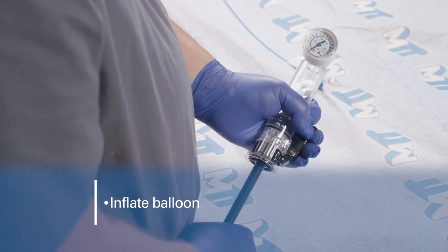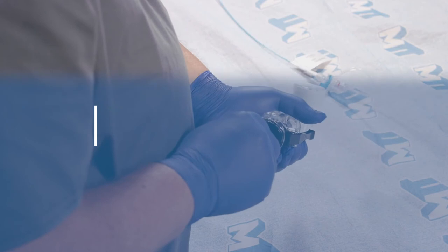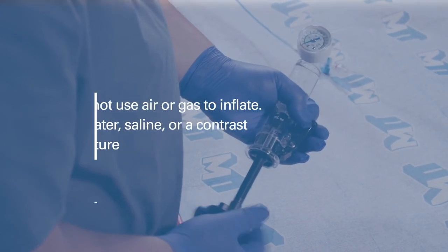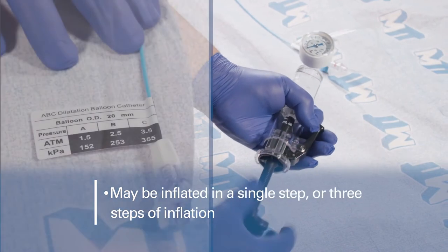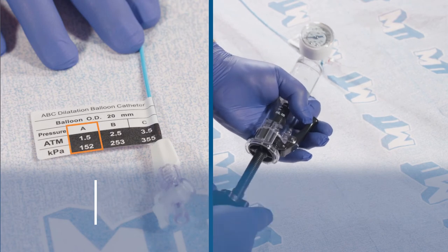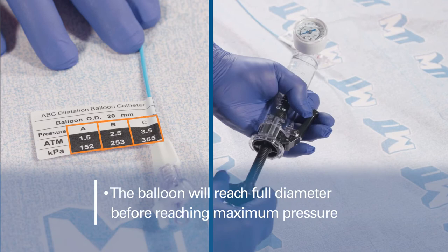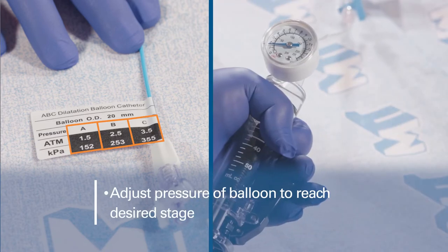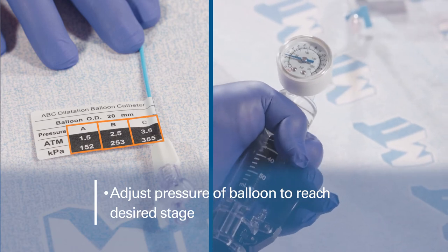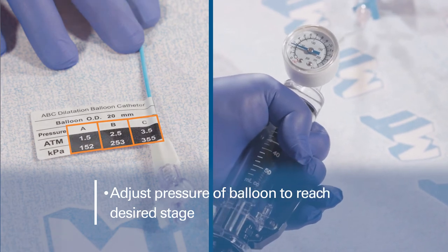Once the balloon's position is confirmed, inflate the balloon using the inflation device. Caution: do not use air or gas to inflate the balloon. The ABC Dilation Balloon Catheter can be inflated in a single step or in three steps per the inflation pressure label. The balloon will reach its full diameter before reaching the maximum pressure. Adjust the pressure using the inflation device to attain the desired stage based on the pressure diameter tag label near the hub on the proximal end of the catheter.